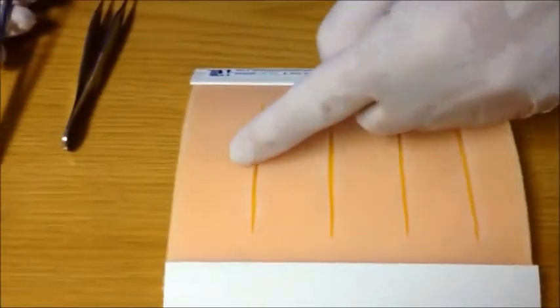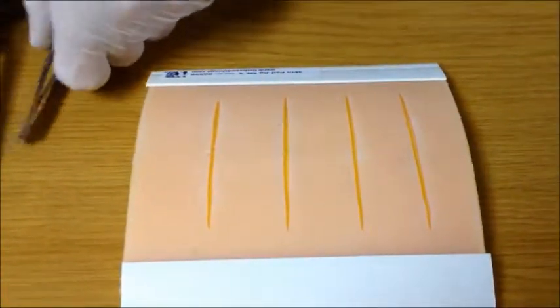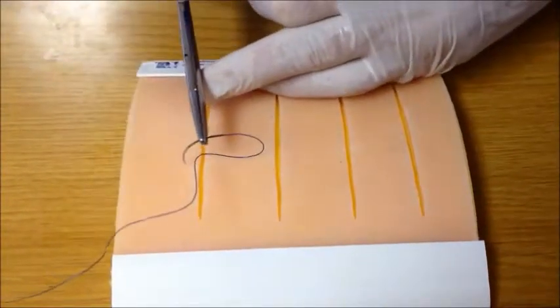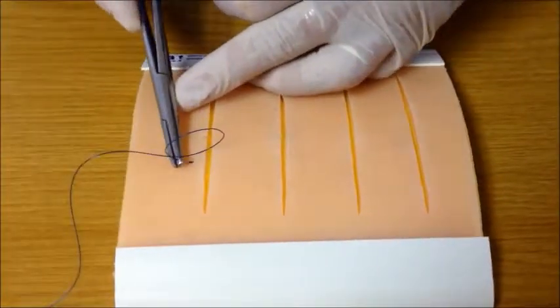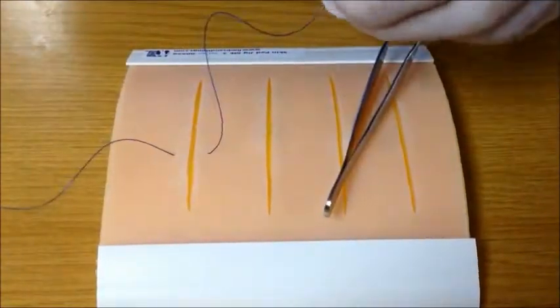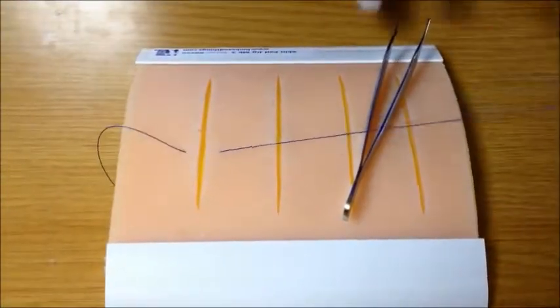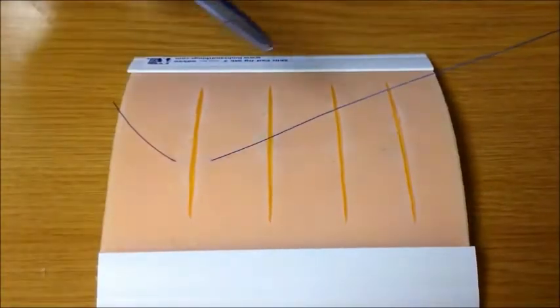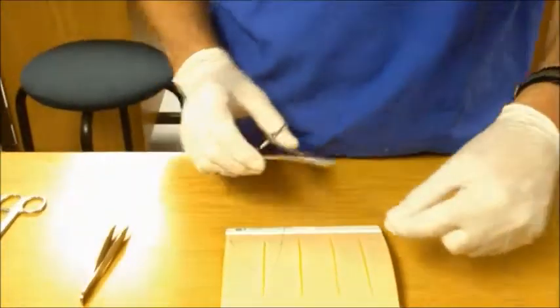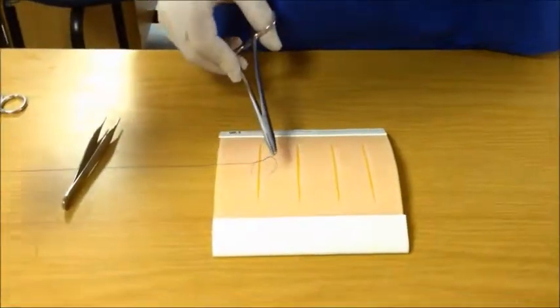When suturing a wound, we suggest starting in the middle and then progressively halving the gaps in between to ensure even distribution of sutures. For a simple interrupted suture, insert the needle at 90 degrees to the skin and with a rotating motion of the wrist, simply twist the needle through. You could also insert on the one end, come out the middle of the wound and insert again. Pull the suture material through, leaving just enough to tie.